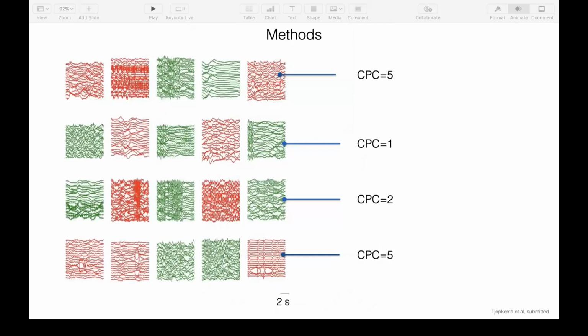So what we did, we took epochs from all our patients, and we had about 900. In the latest paper, we used 600 patients to train a net, and 300 patients to test the net. Actually, it was an external validation. So 600 to train. And what we did is that every hour we took 10-second EEG epochs for 5 minutes. So that's 30 epochs.